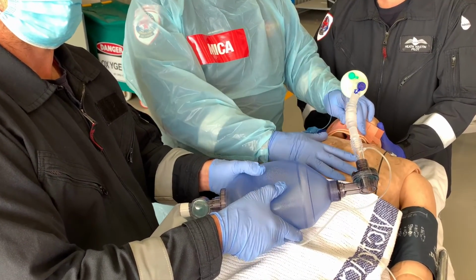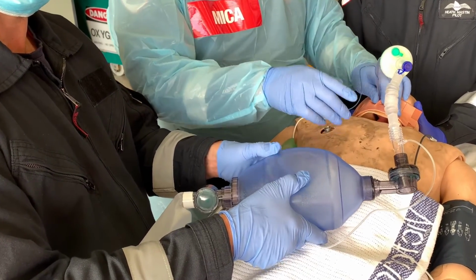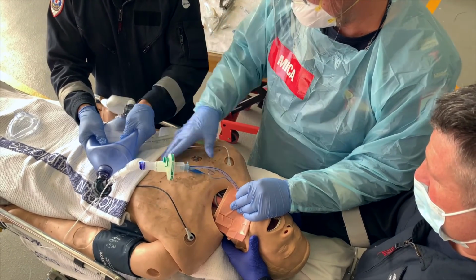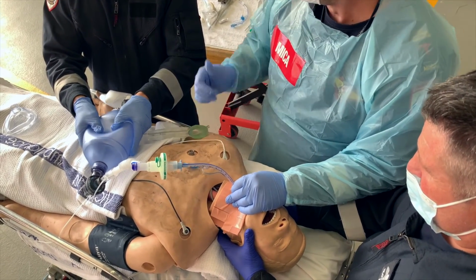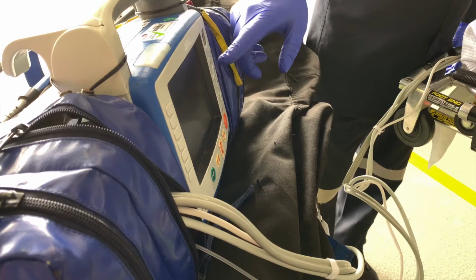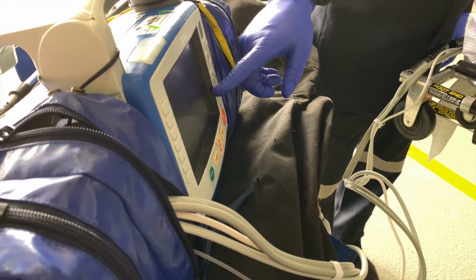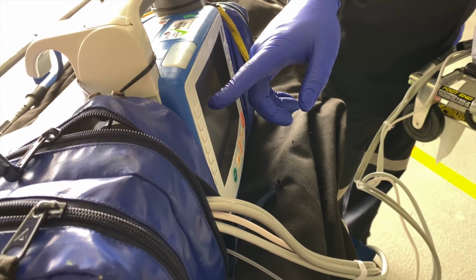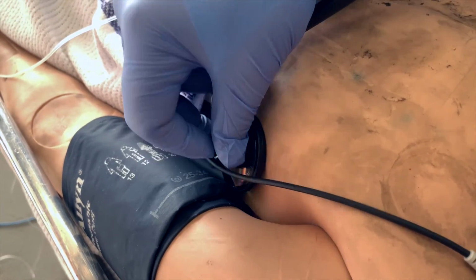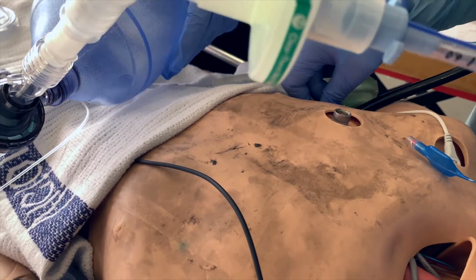The lead clinician will identify and verbalise a manual ventilation strategy and target physiological parameters to the team. It may be prudent to focus on reoxygenation first prior to securing. Have the team cycle through all other vital signs to provide an overall awareness of the patient's status post-procedure, and auscultate the chest bilaterally to assess ETT depth.